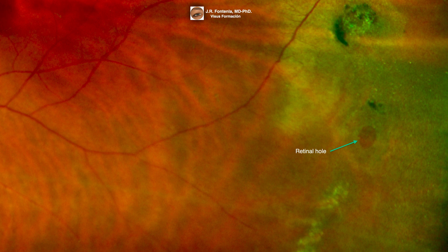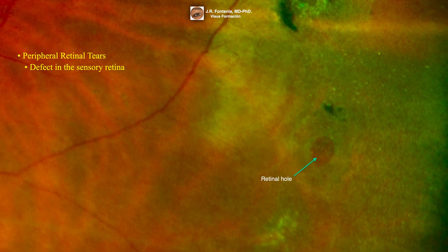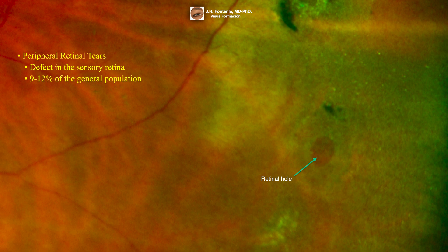Pointed by the arrow we can see a peripheral retinal hole. Peripheral retinal tears are defined as isolated tears due to a defect in the sensory retina caused by traction of the vitreous after an acute posterior vitreous detachment. Its prevalence is 9-12% of the general population.